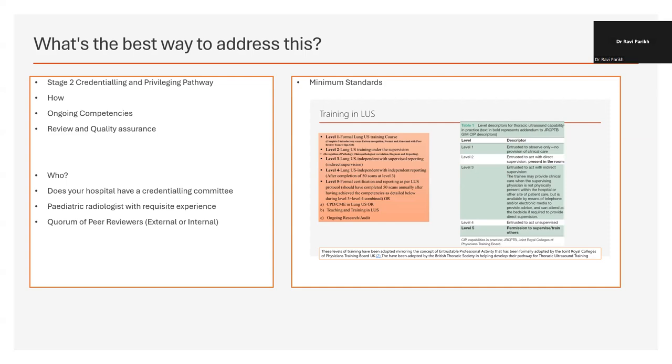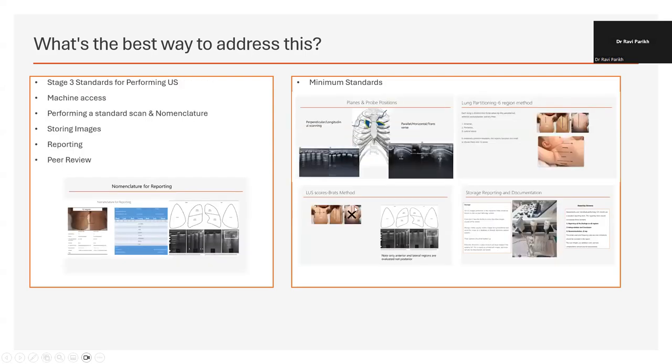So for the purposes of going to level four and achieving a standard of credentialing, once you have done, say, 50 scans, and you've got a good variety of pathology, you will develop the confidence to start making decisions on your scans. And I would recommend that you continue doing chest x-rays where you feel they are appropriate. Because again, there will be images where you feel confused, where you might want to make therapeutic decisions. In those situations, getting a chest x-ray is not a sign of weakness. It's adjunctive evidence that your lung ultrasound is accurate. Now, in our unit, it's mandatory at the moment to get it done. I know that in Paris and certainly in Southampton, we didn't, and that was acceptable practice based on the guidelines over there.